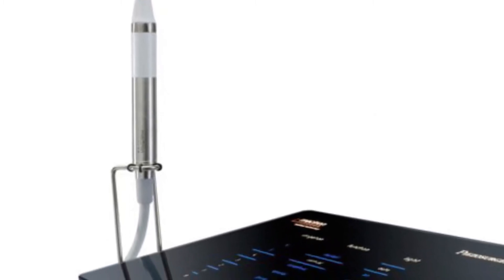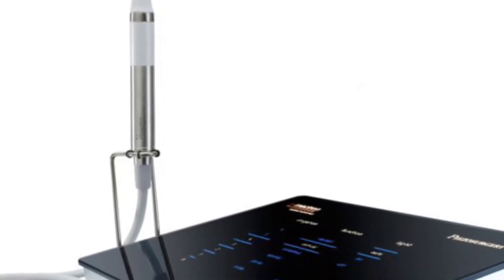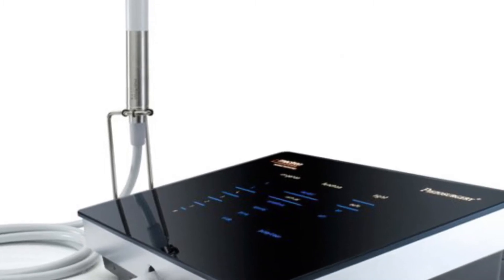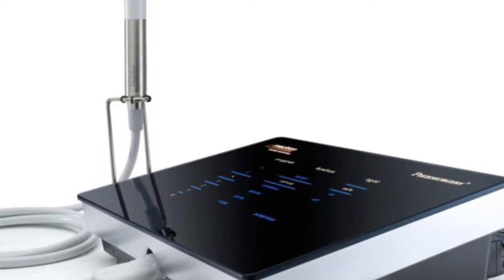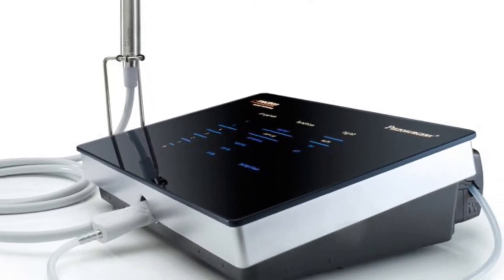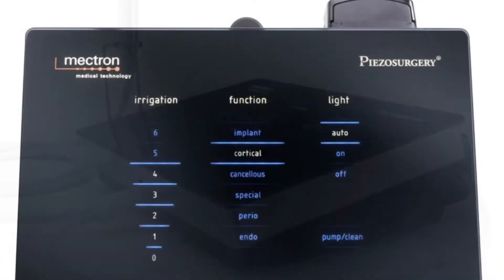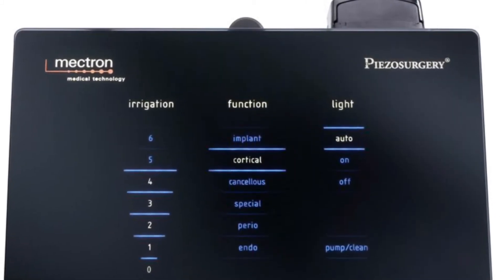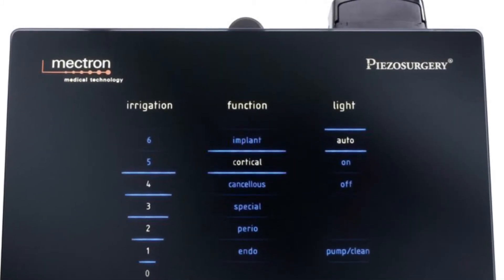Ortopuncture treatment generates small microperforations along the palatal midline. Piezo surgery corticotomy is essentially bone surgery, creating small ultrasonic microcuts along the palatal midline. The piezo surgery precisely cuts hard tissue while avoiding injury to soft tissue.